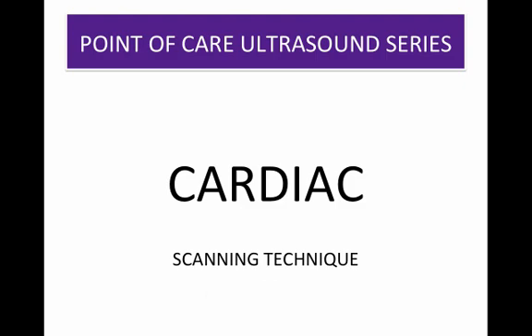We would like to welcome you to this installment of our Practical Point of Care Ultrasound series, with the focus of this module being the bedside cardiac ultrasound, limited to detection of pericardial effusion and cardiac standstill.